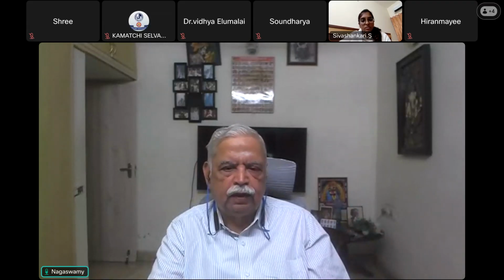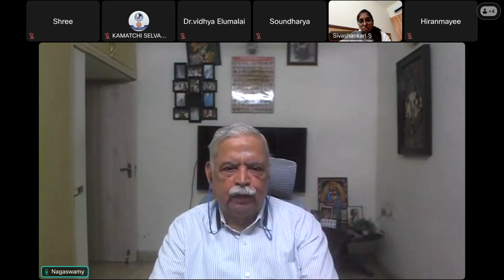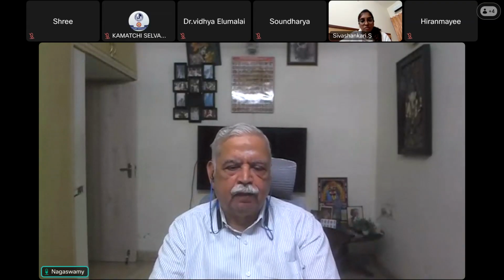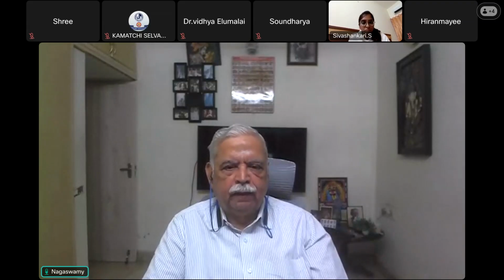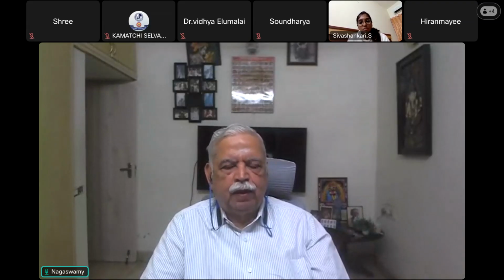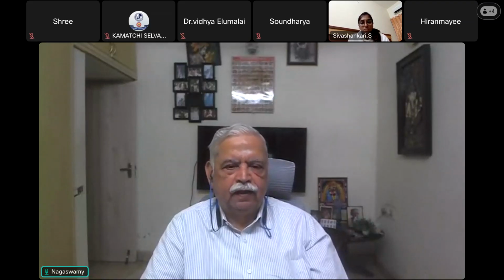So these are the two basic modes. Apart from that, you cannot be endlessly taking time to deliver the volume. So there is also a time element, because in a normal respiratory pattern, when we breathe at 20 breaths per minute in normal physiology, that means for 60 seconds we are breathing 20 times, which means for each breath we are spending 3 seconds. 20 into 3 is 60 seconds, 1 minute.